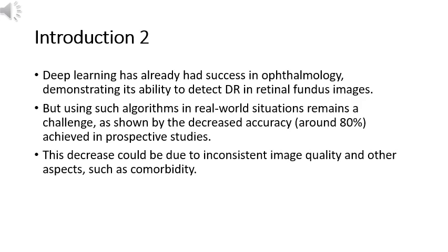Dataset quality assessment is normally taken for granted, with researchers using trainings and certifications for photographers. 17,18 Or manually cleaning the datasets. 19 Some authors have even used quality filters on algorithms before training the algorithms. 20 Optretina is a telemedicine platform which performs general screening for retinal diseases using non-mydriatic cameras and human evaluation by a retinal specialist ophthalmologist. 21 Our research in artificial intelligence deals with both data acquisition and the diagnostic steps of our telemedicine platform.